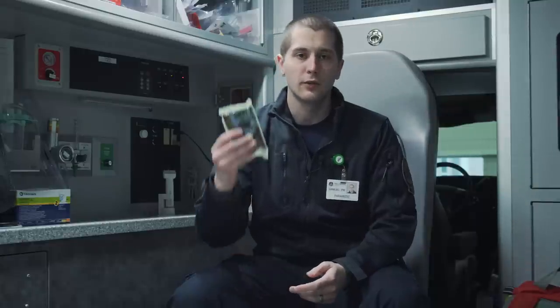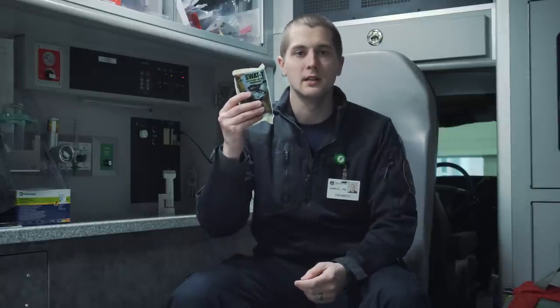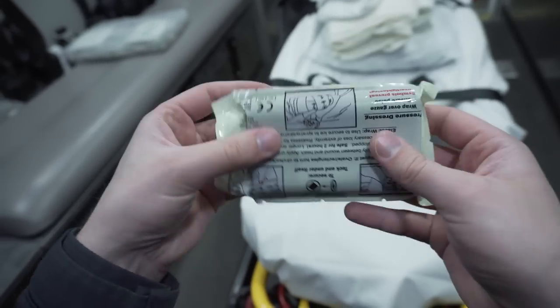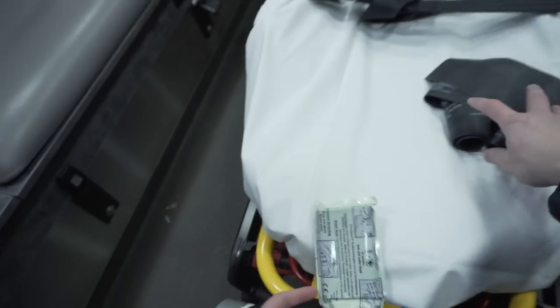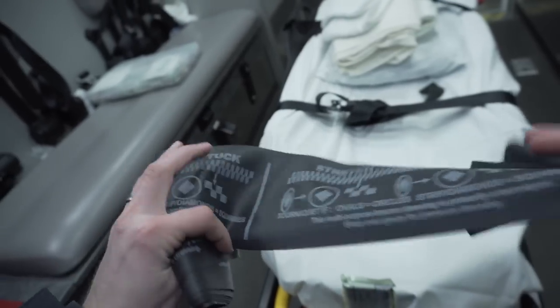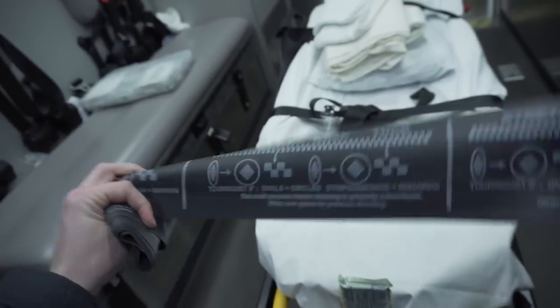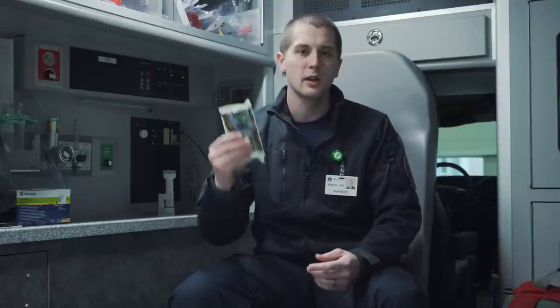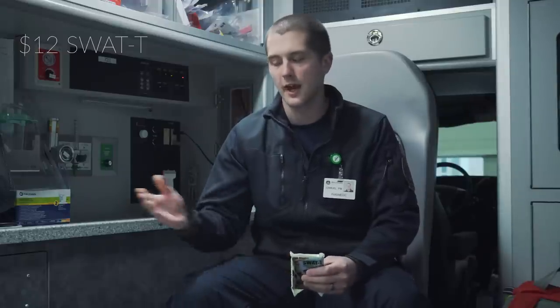The first item in this kit is going to be a tourniquet. For this kit I've chosen the SWAT-T — a stretch wrap and tuck tourniquet, which is a long elastic band that can wrap around an extremity and occlude blood flow if there's a major laceration or serious bleeding. This tourniquet can also act as a sling or a compression bandage, making it relatively multi-use. It will run you about $12 on Amazon, which is pretty good compared to the CAT tourniquet which will run you almost $30.